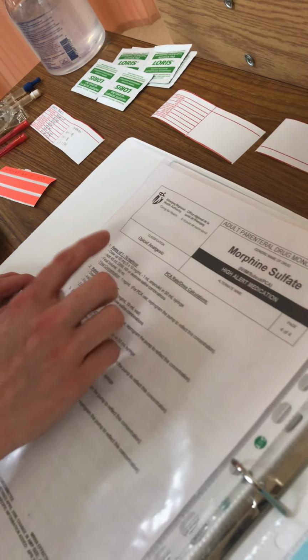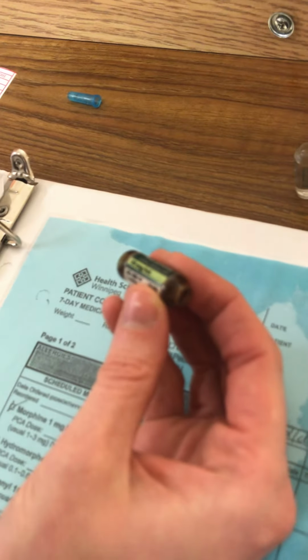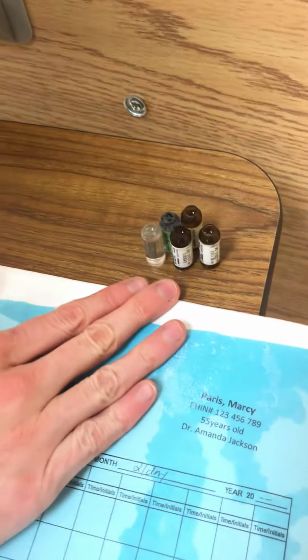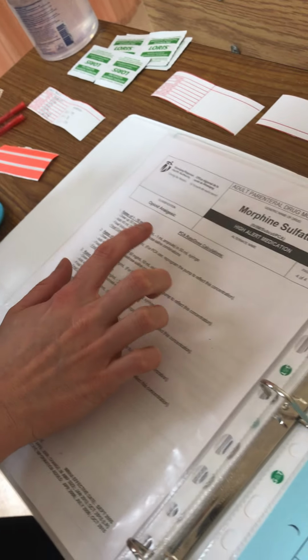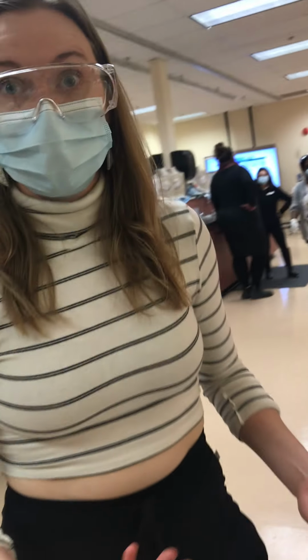Finally, I'm also going to look at the PCA rate and dose calculations. So I'm going to be making this first recipe. I'm going to be drawing up 50 milligrams or 5 milliliters of morphine in ampules. The ampules are right here, and each of the ampules should say 10 milligrams per milliliter, as it says here. I will add the 5 milliliters to a volume of 45 milliliters. So I'm going to need to take out 5 out of that for a final volume of 50 milliliters with a final concentration of 1 milligram per milliliter. So I understand what I'm going to be making, and I can do my first check.